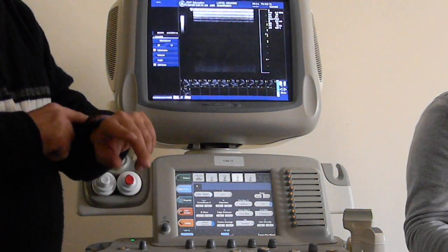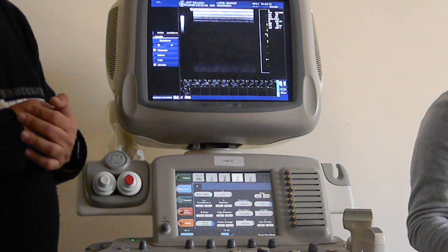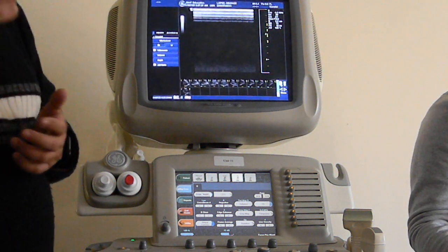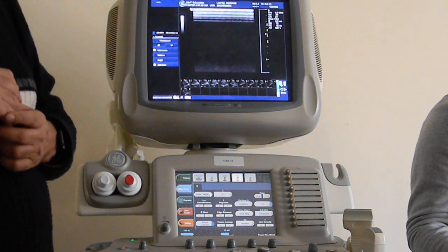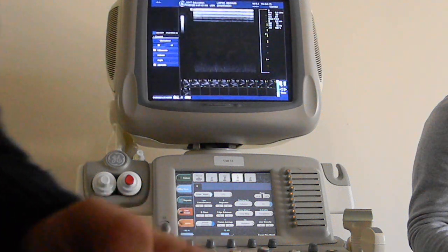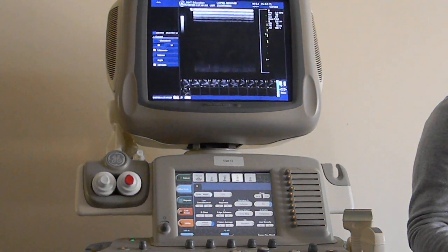What does it say? Spectrum Doppler. Now what does it say on this one? 3 minutes? 3 minutes? I'll just end this one for now.